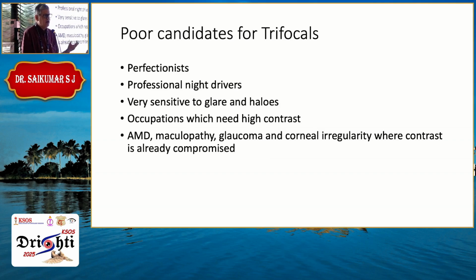The poor candidates are the perfectionists, the professional night drivers, patients who are very sensitive to glare and halo. You just put them on the slit lamp, shine a torch light and they say, I can't tolerate this light. They're probably not a very great candidate because they're going to be very sensitive to this. Occupations which need very, very high contrast, please don't. Even with EDOF lenses, some people feel that EDOF is a compromise on contrast sensitivity. So use a normal monofocal with spectacle correction for patients in some occupations. AMD, maculopathy, glaucoma, obviously not too great.